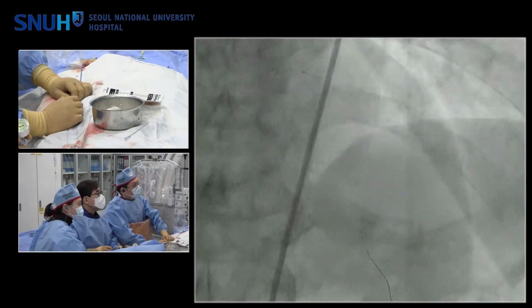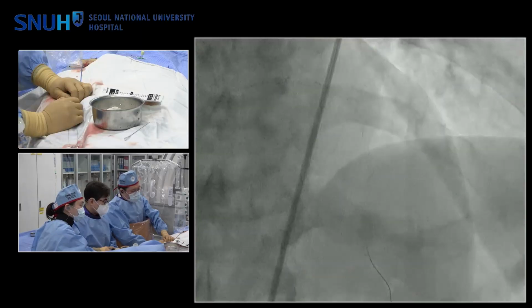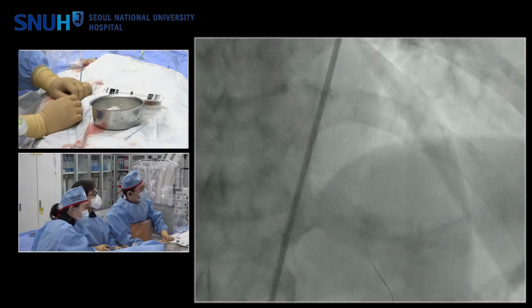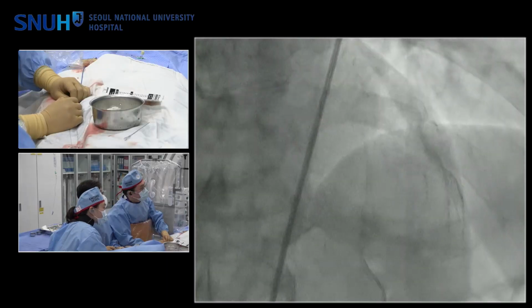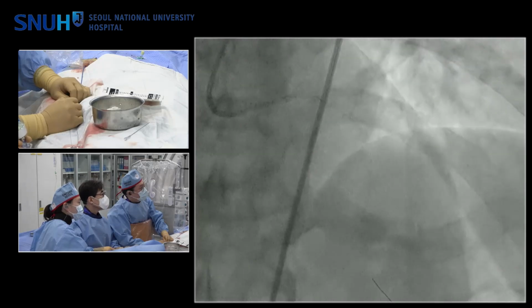And we found then that we can show you OCT finding. Okay, we'll go to high pressure here, up to 20. Actually, we found a very enlarged lumen even after the IVL low pressure ballooning. Actually, this I think it's very effective. Okay, go slowly. Up to 4.